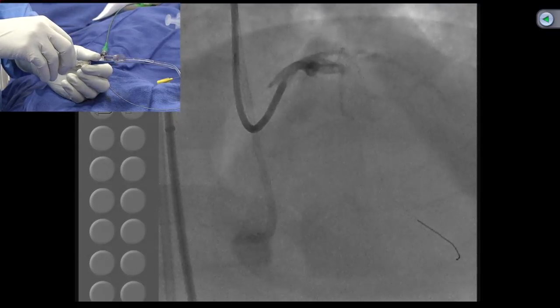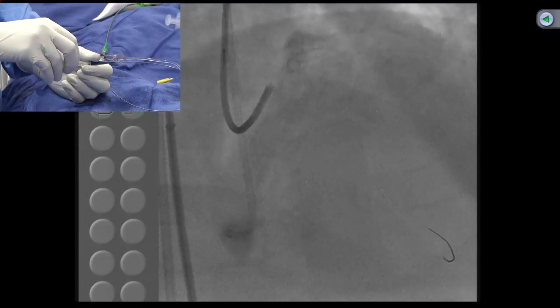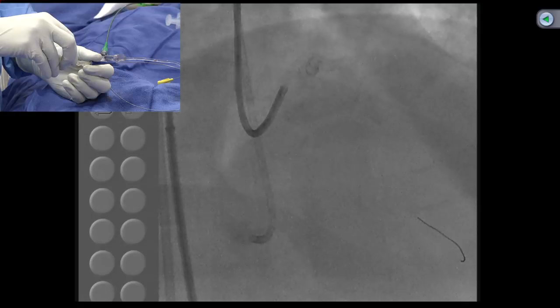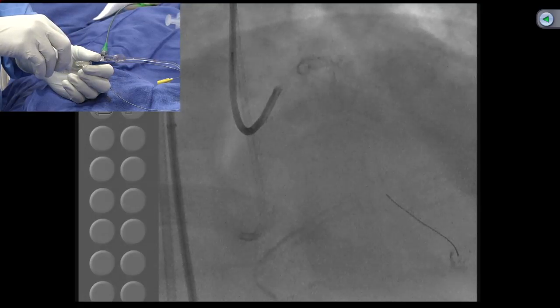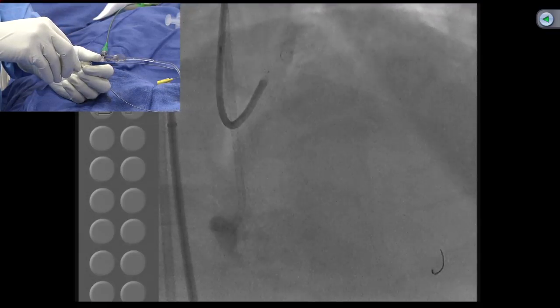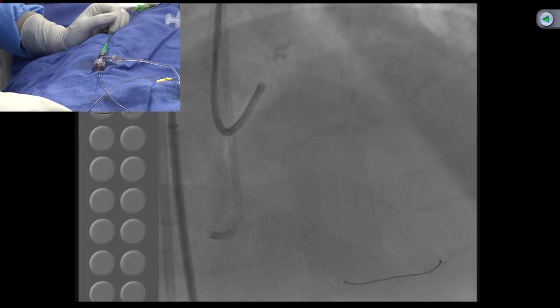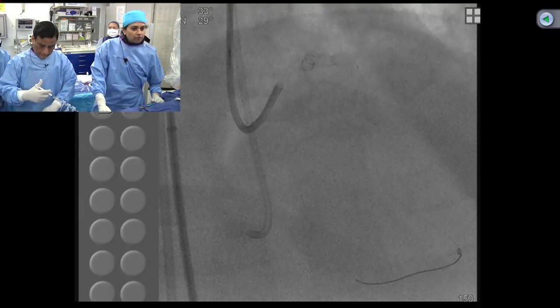Now, PVCs are very common when you advance these wires. Should we be worried about it? Probably not. Are you in the main channel or distally? When you reach the distal septal, I think that's good. We went through. Good. So this is the modified technique, which I use.